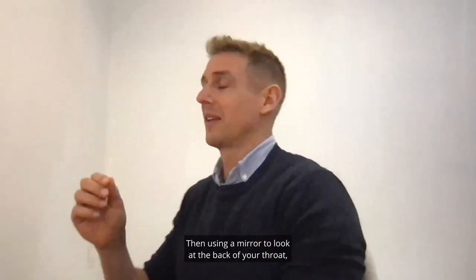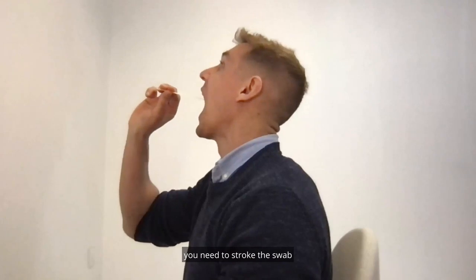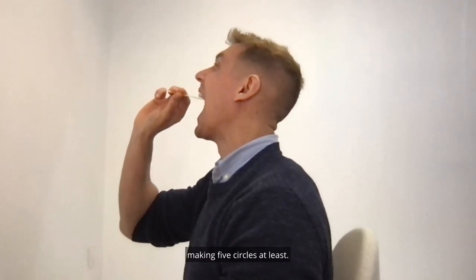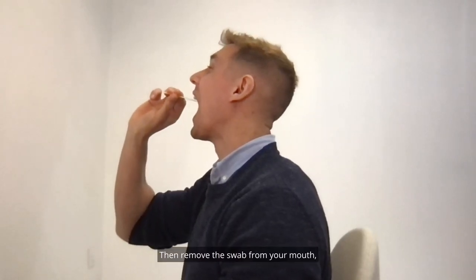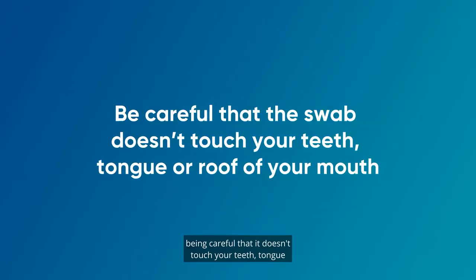Using a mirror to look at the back of your throat, you need to stroke the swab across the back wall of your throat softly, making five circles at least. Then remove the swab from your mouth, being careful that it doesn't touch your teeth, tongue or roof of your mouth as you take it out.